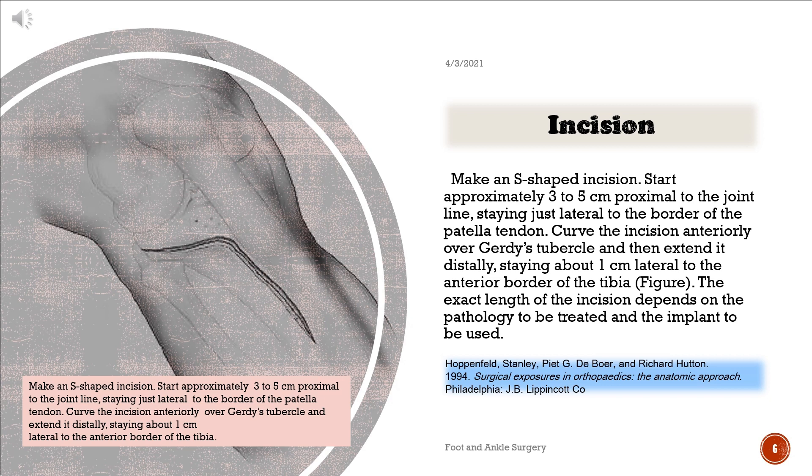Make an S-shaped incision. Start approximately 3–5 cm proximal to the joint line, staying just lateral to the border of the patellar tendon. Curve the incision anteriorly over Gerdy's tubercle and then extend it distally, staying about 1 cm lateral to the anterior border of the tibia. The exact length of the incision depends on the pathology to be treated and the implant to be used.